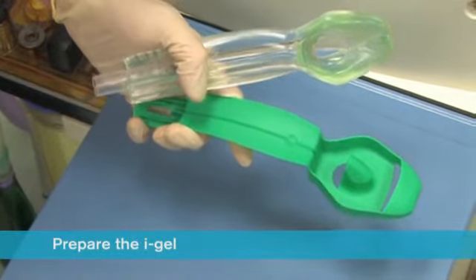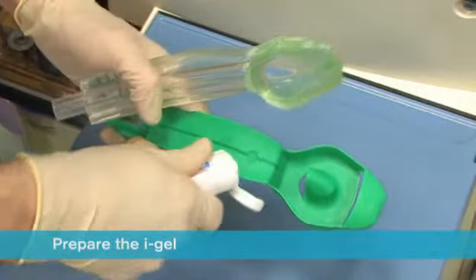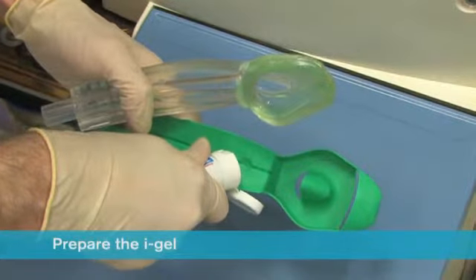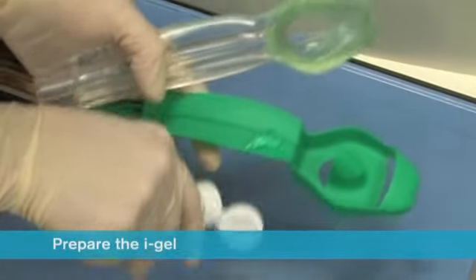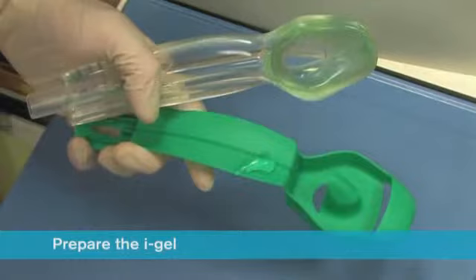Place a small bolus of water-based lubricant, such as KY Jelly, onto the middle of the smooth surface of the cradle in preparation for lubrication. Do not use silicon-based lubricants.